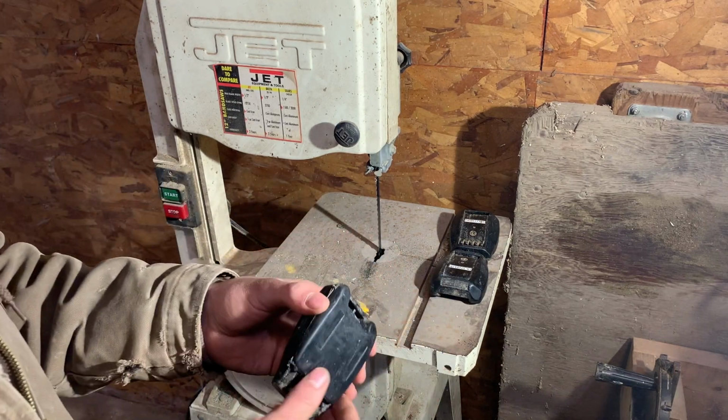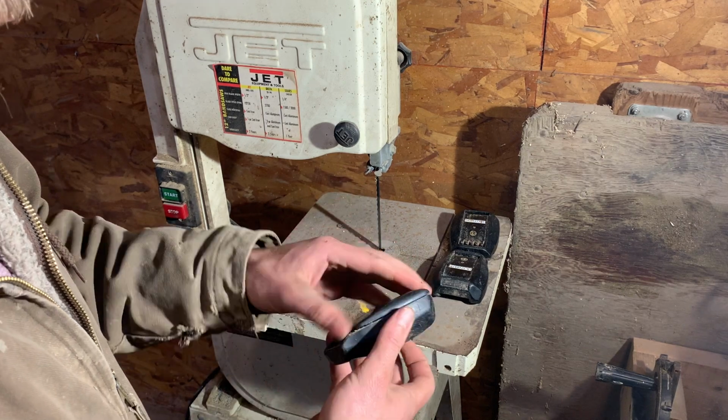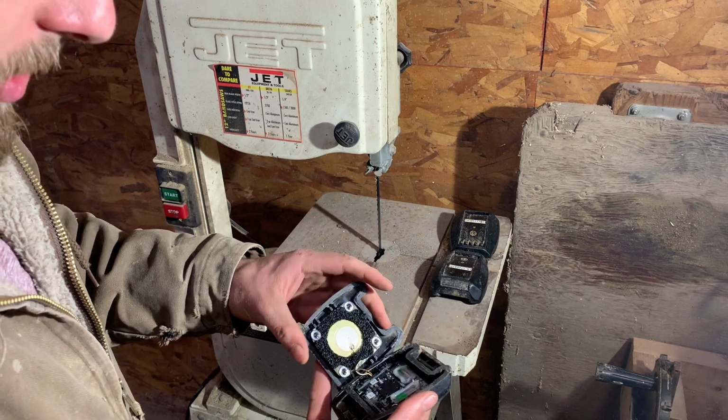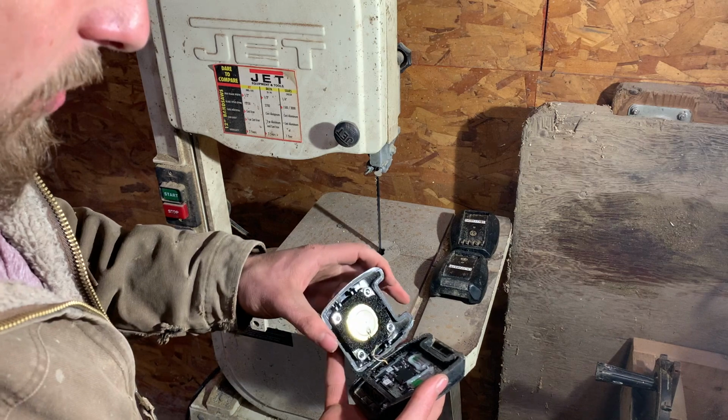There we go. They just follow the line around there. There's a little line there, just follow the blade through. And then next you just open it up. And so right there are the wires that I was talking about. On the left side, you want to go as shallow as possible, and the wires will be right there.